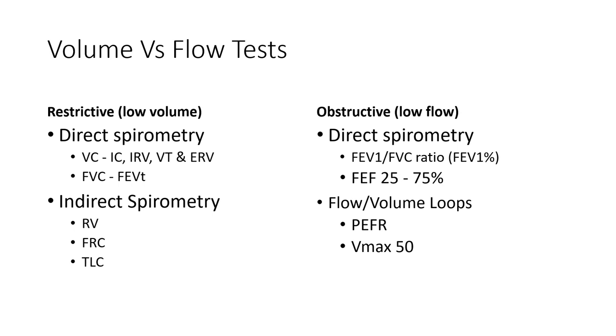All right, volume versus flow test. So this is another way of looking at that sort of division there. Direct spirometry versus indirect spirometry. Things that are directly measured: vital capacity, inspiratory capacity, inspiratory reserve volume, tidal volume, ERV, FEV time, forced vital capacity, just from direct spirometry, right? So we can see those things.